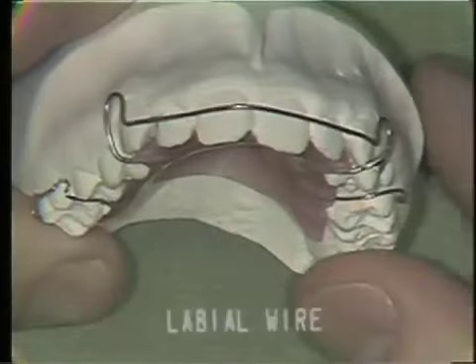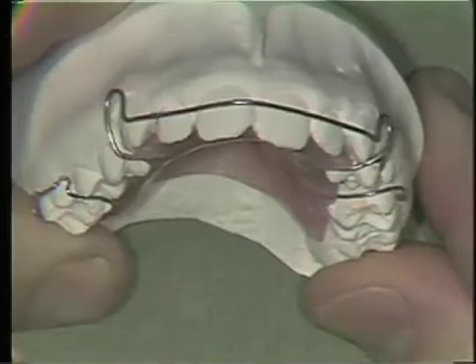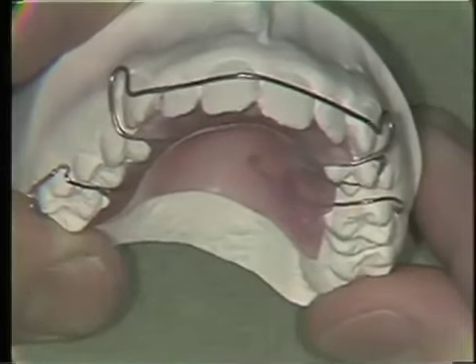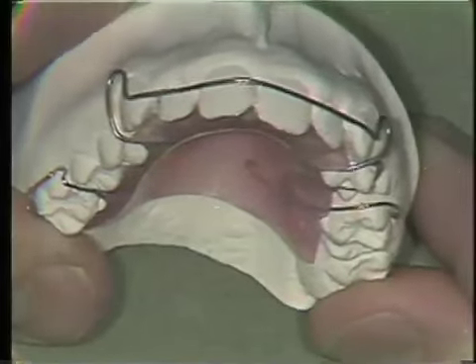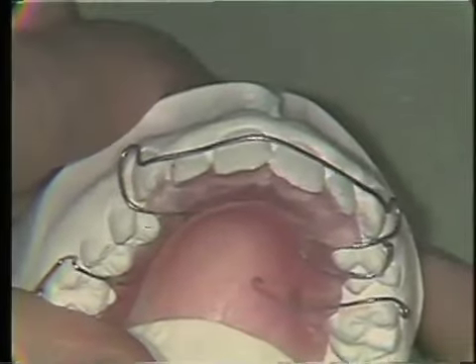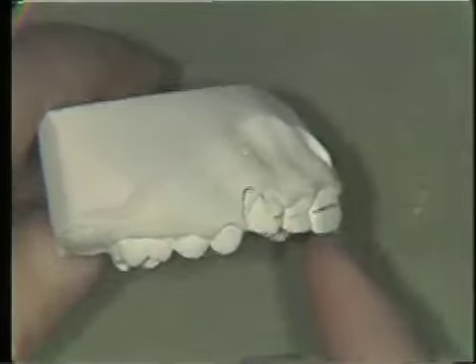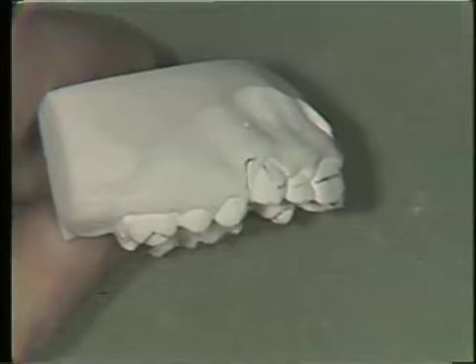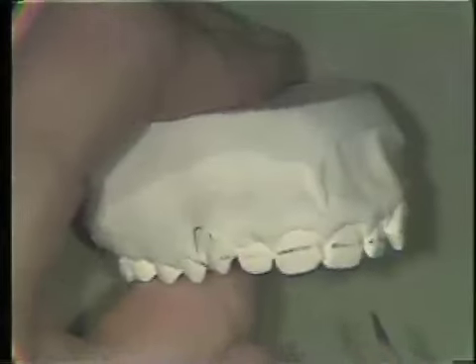The Holley labial wire is used in almost all removable orthodontic appliances because it may serve either as a large clasp to increase the retention of the appliance in the mouth or as a spring that can be used to tip incisor teeth to the lingual. The labial wire is referred to as the Holley labial wire after the man who first designed this wire. To bend a labial wire, the first step is to prepare the work model by trimming off the anterior portion of the base to allow easier access to the labial surfaces. A pencil outline is marked on the work model along the course that you would like the wire to follow.